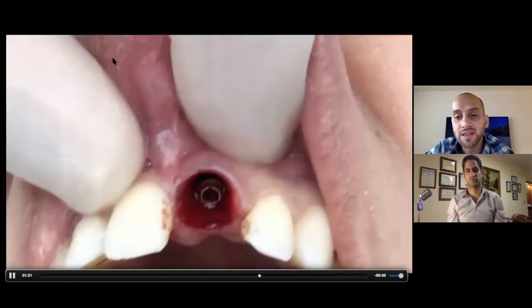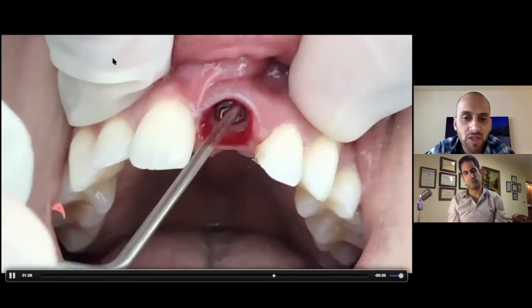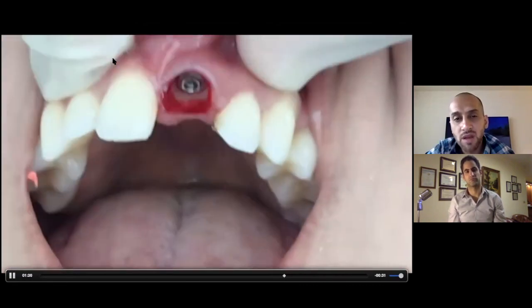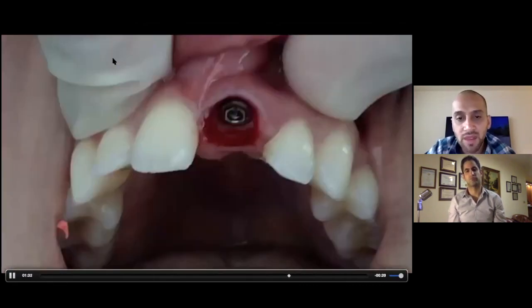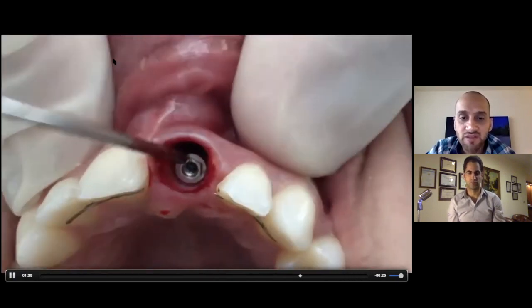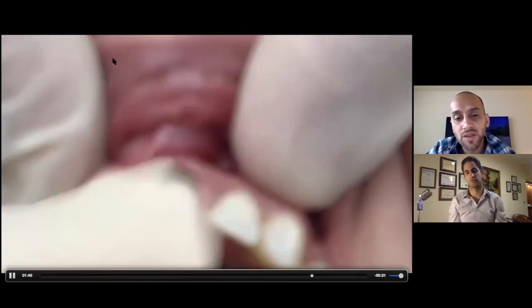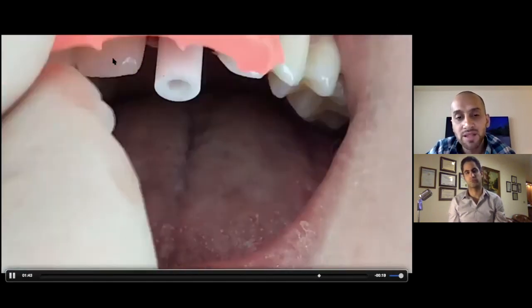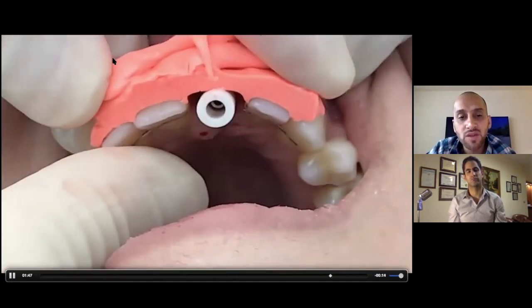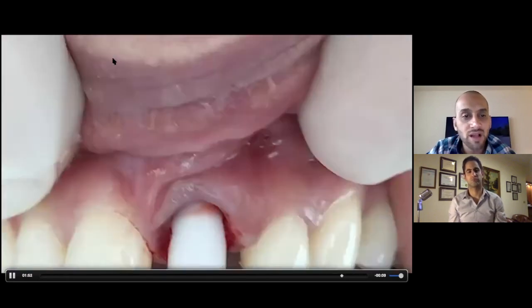And now that gap has to be filled with some allograft. You can use any type of bone that you want. You know more about this than I do. A little bit of bone milling has to be done on the palatal to make sure that the abutment is going to seat. But that gap right there, in this case, was filled with allograft and LPRF. The zirconia abutments that we talked about earlier must be tried in, because if there's any bony interference, they will not seat. We check a guide to make sure that the abutment is going to give us a screw-retained restoration, as you mentioned earlier yourself.